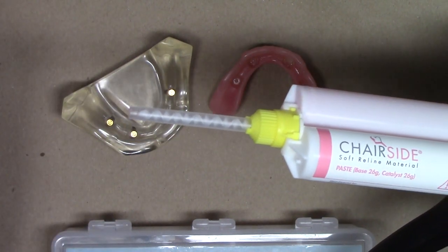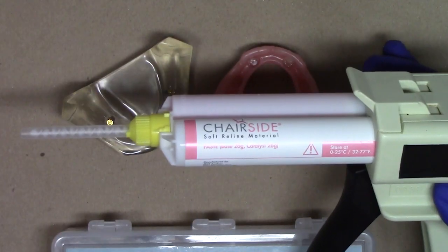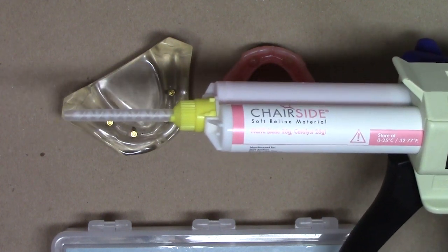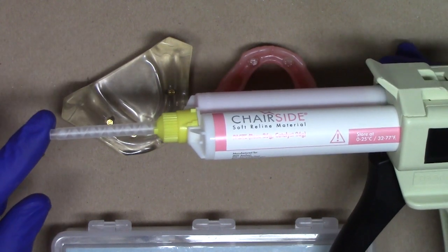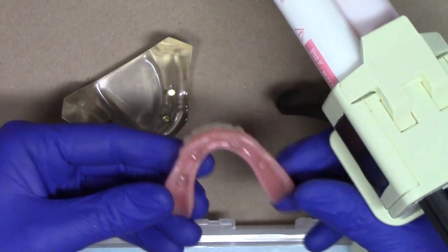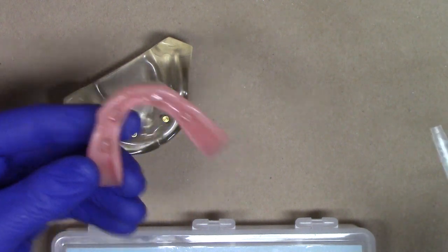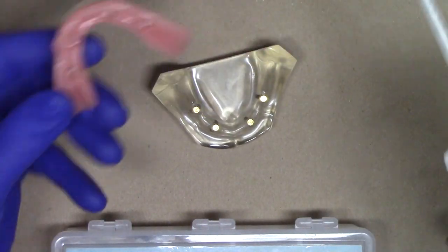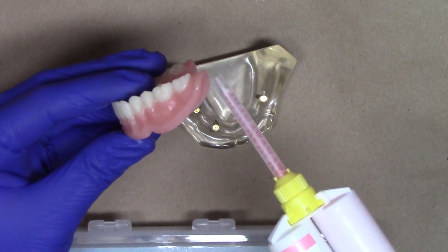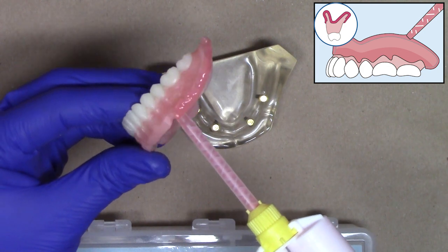You have about 2 minutes of working time while this is being applied to the denture, while you're mixing and carefully placing inside of the complete denture, and then the total set time is about 5 minutes. So what I'm going to do is again show you where we've provided those areas of relief within our complete denture. I have my patient that I placed my LODI implants on, and what we're going to do is I'm going to start dispensing along the border of the complete denture all the way across.